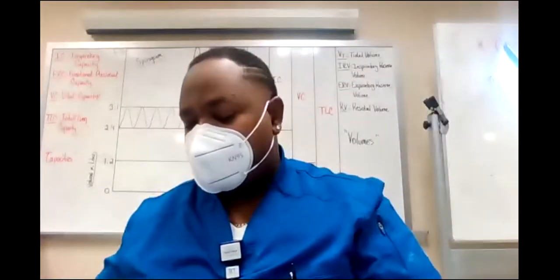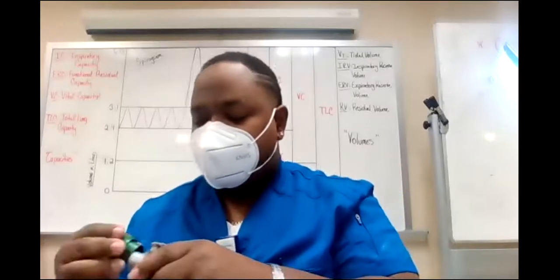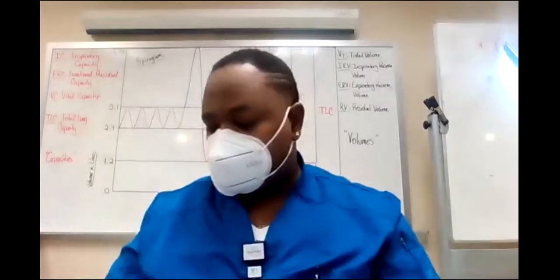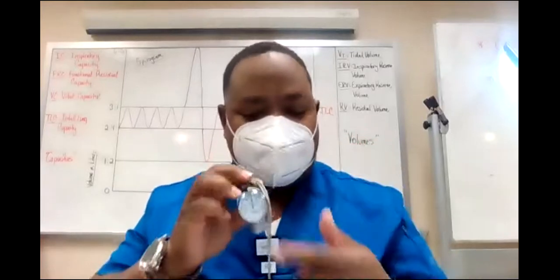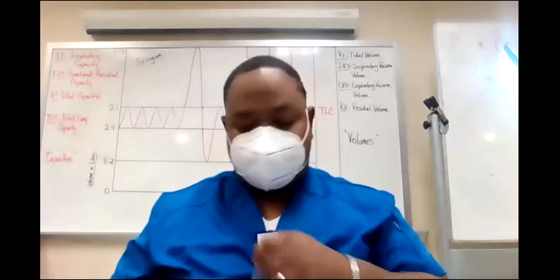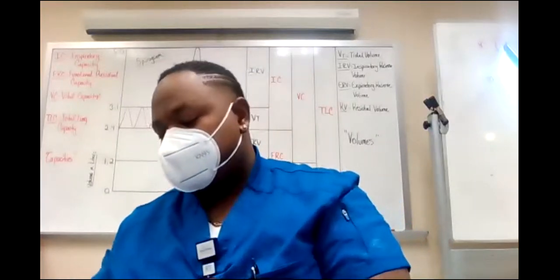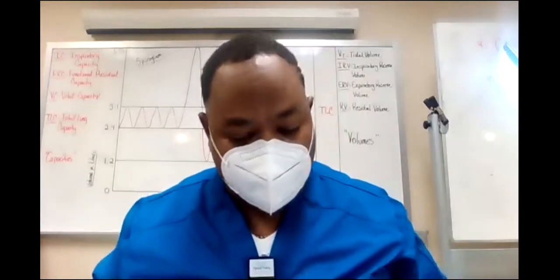Okay, and these are very expensive, but they put a mouthpiece on here and they will blow into it and you tell them to breathe in and breathe out. So you breathe out and this little dial will go around and tell us how many liters did you just exhale, okay? That's called a Wright's respirometer. All right. Any other questions for homework number one?